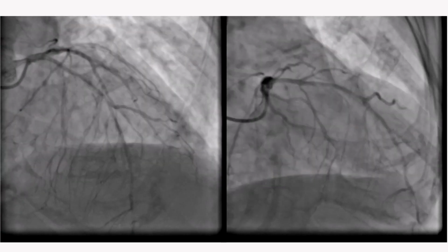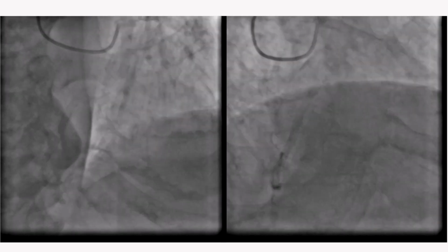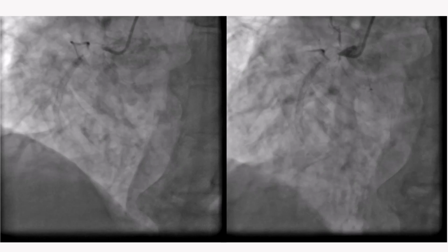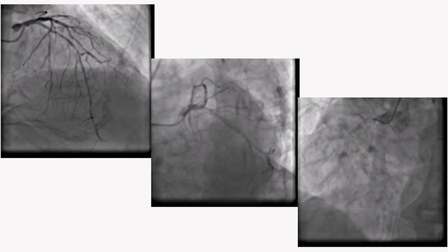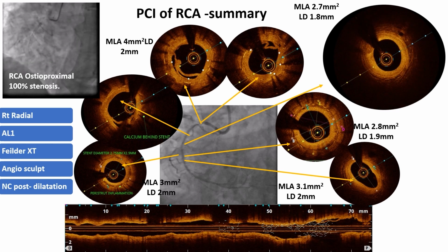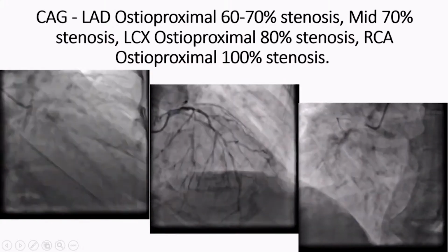You can see the angiogram showing significant disease, a diffuse long segment lesion of the LAD and LCX, and you can see the right coronary total occlusion. Four days prior to the procedure, we thought we would do the right coronary angioplasty and stenting to give a good backup to the left system. So we used a right radial approach, AL1 catheter, that is a 7 French guiding catheter, using the slender sheath. With this note, let me have a discussion.